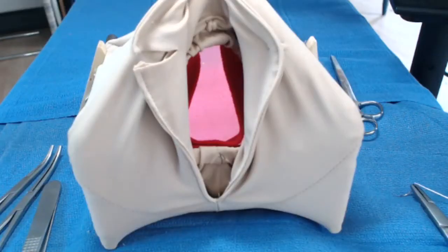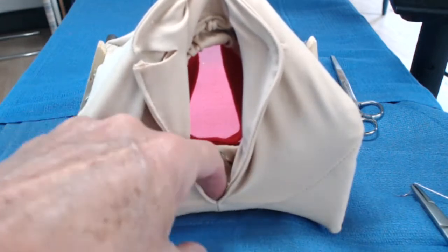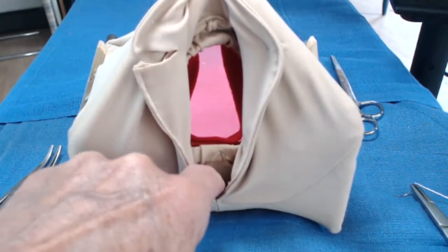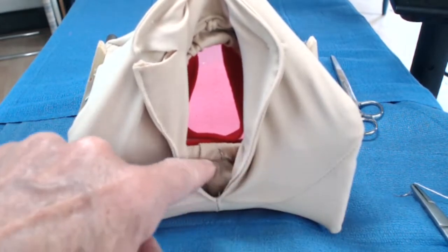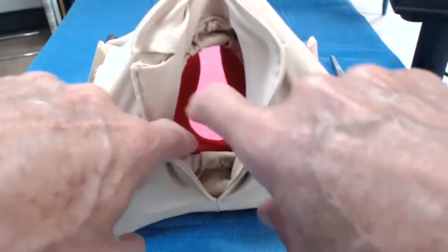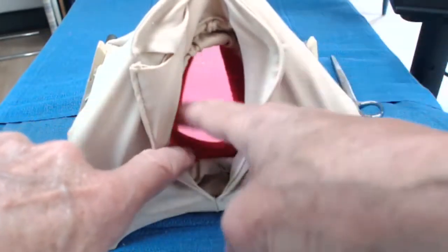All right, we'll go to the workstation and here's the model. The model is a vulva. The hymen is right here, so this would be the fossa or vestibule, or what I prefer to call the sublabia folds. I'm using what would be the cervix in a birthing model to be the hymen for the purposes of our demonstration. I've added two strips of fabric — one comes from the top down and around; this would be the bulbocavernosus muscle.